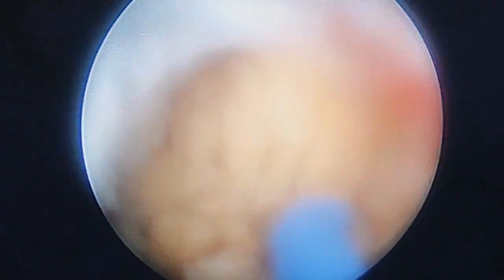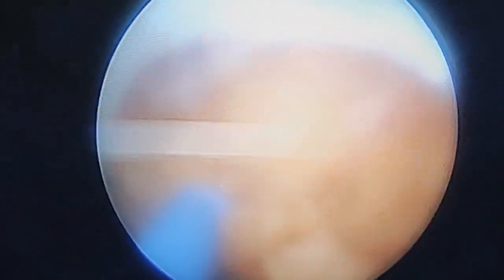Talk to us. Yes, we are making some steady progress. The stone burden is much reduced now. You can see the stone fragment there actually is moving now. Yeah, so we're almost done with the procedure. The sheath actually was helpful in this case. If it was a standard PCNL, the bleeding would have been more severe.